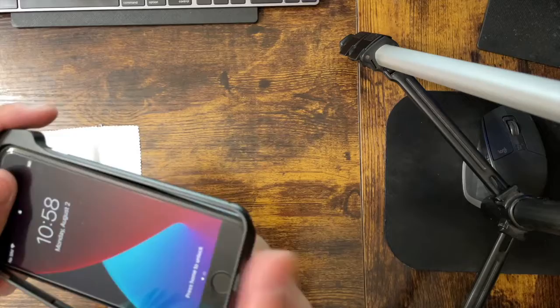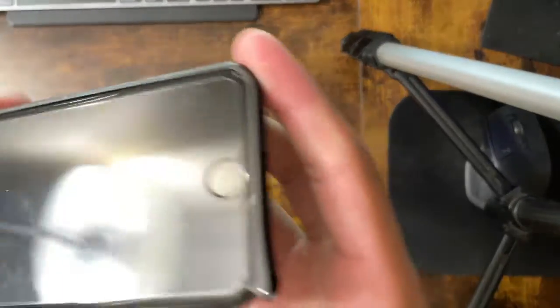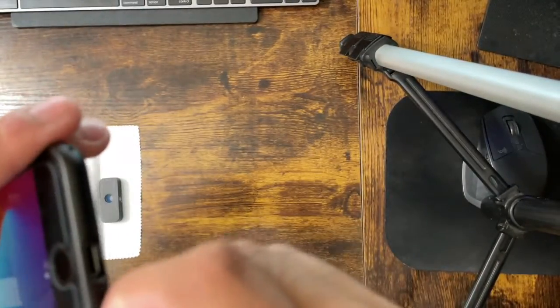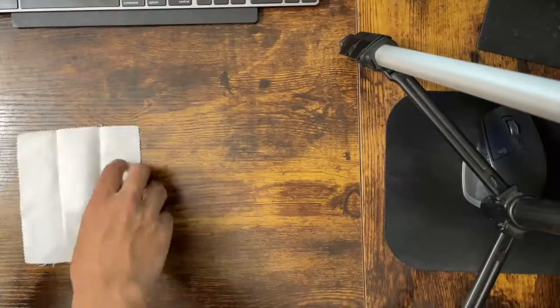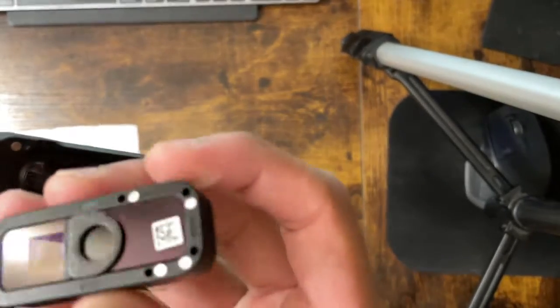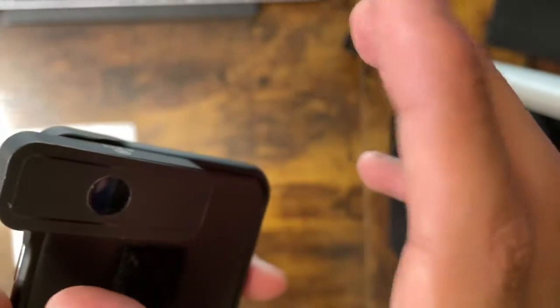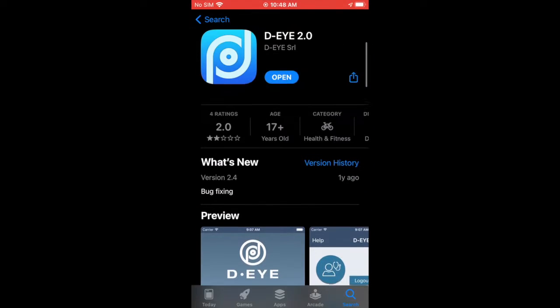So to place the iPhone in, we are just going to place it in and surround it properly. And then at the end, we will clip on the last piece to secure it. And it's just a metal clamp, so you can unhook it and hook it. Now we will place the retinal camera attachment onto the casing. The casing has two little pegs and two magnets, and those align with the two magnets and two holes on the retinal camera.